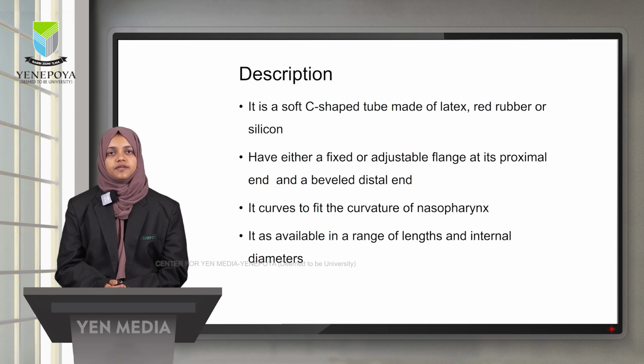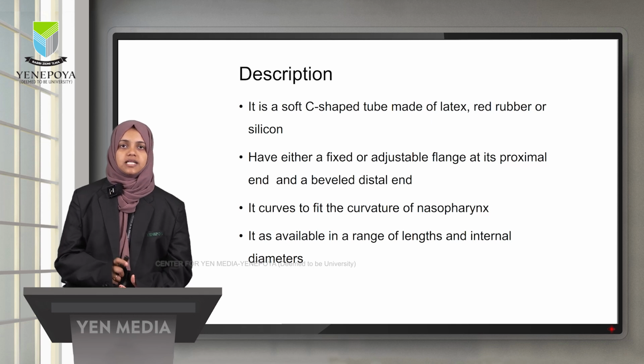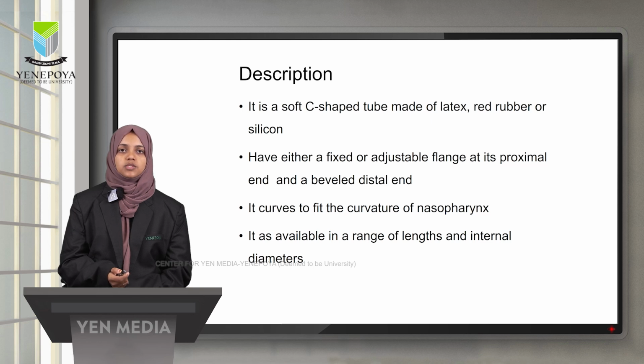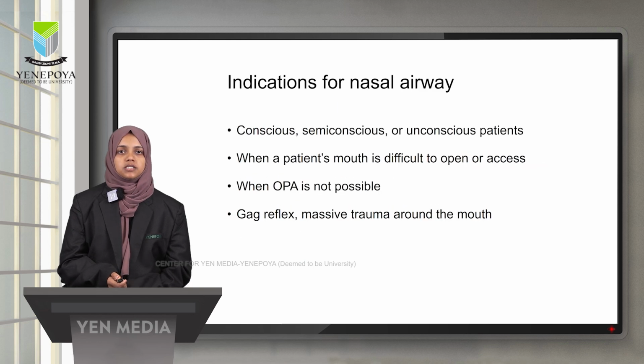It has either a fixed or adjustable flange at its proximal end and a beveled distal end. It curves to fit the curvature of the nasopharynx. It is available in a range of lengths and internal diameters which is suitable for patients.